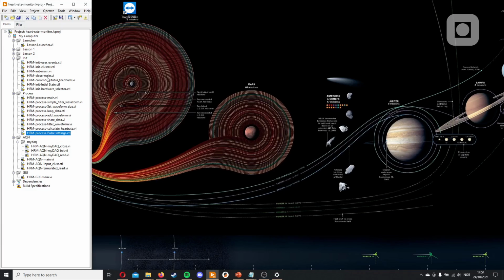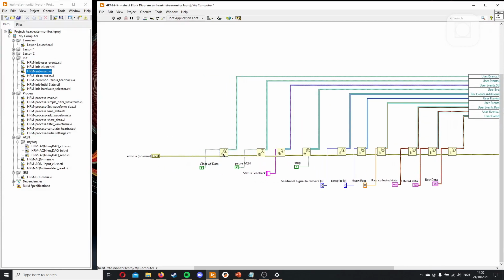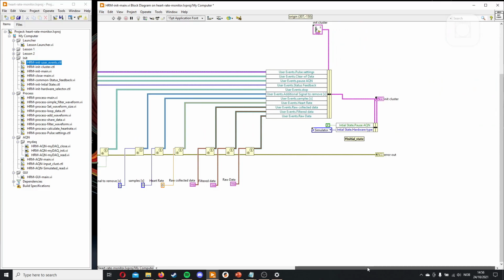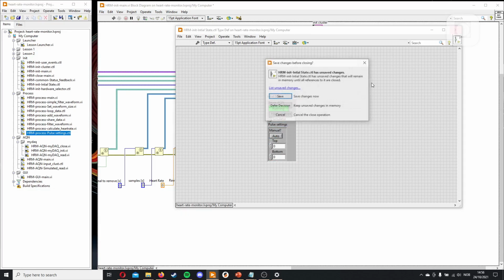So now that we have our cluster, we can start by making the user events. And we do that the exact same way as we always do. While we're here, we want to also define these values from the beginning, or at least we want to define that it should start in the auto way, in the old way, because then there is no settings needed. So what we need to do that is to go into initial state and add the pulse settings. And by default it's auto, but we can specify that.